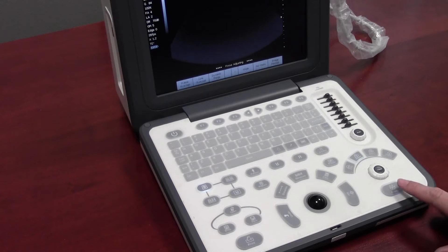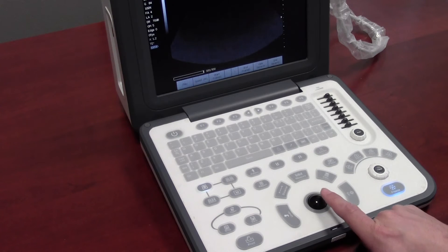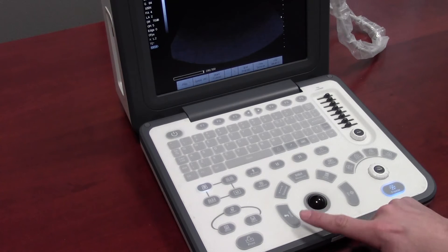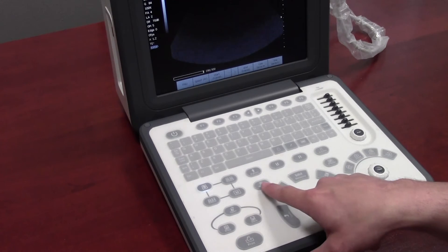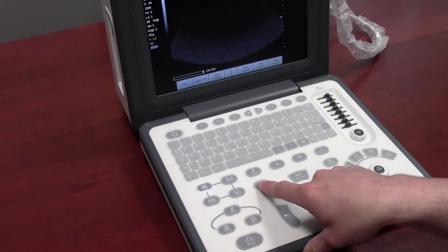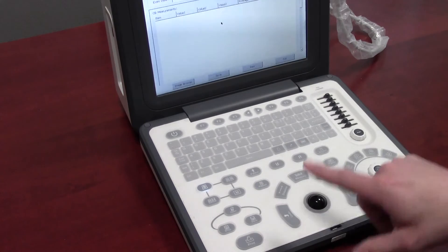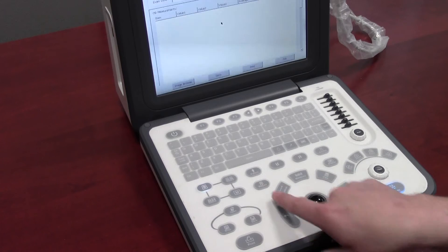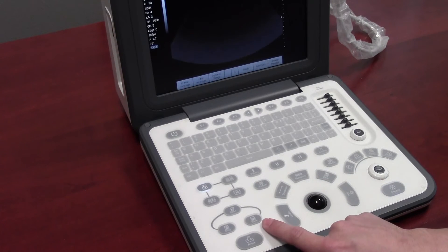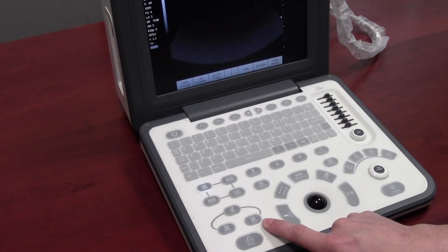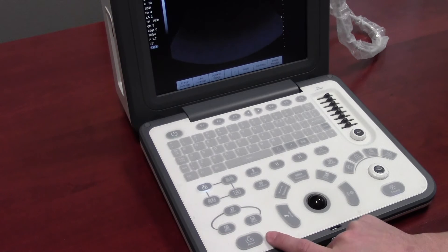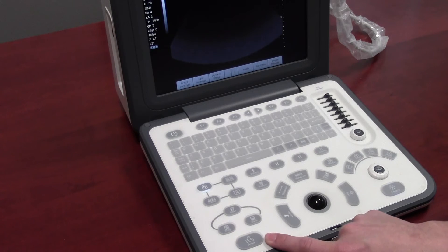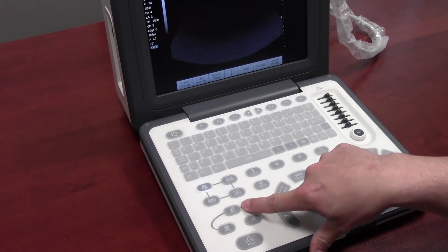Once you have optimized your image, press freeze. You can use the trackball to scroll through the cine loop. You can now take measurements using the trackball and calculations. Press report to view the report of all the calculations that you have taken. Press the save key to save the image, the snap key to take a snapshot, the print key to print from the user interface, or the open key to open up another study.